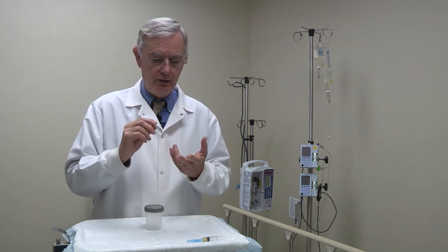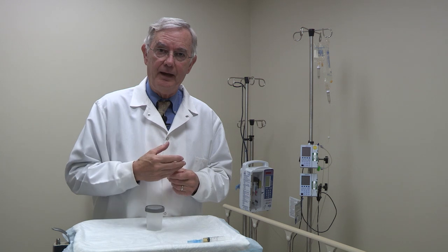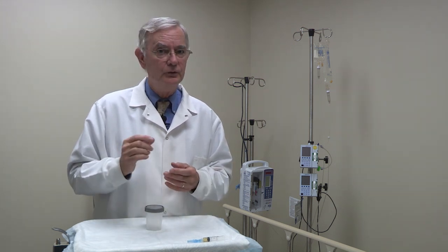For symptomatic patients or those with painful urination, urgency, frequency, one specimen is usually adequate for diagnosis, and another could be collected 48 to 72 hours after initiation of therapy. For asymptomatic patients, 2 to 3 specimens may be necessary. Pooled 24-hour collections are not helpful in microbiology and should be discouraged for culture. It is helpful on the requisition to indicate whether or not the patient is symptomatic because it helps the laboratory to interpret low-count quantitative urine results.